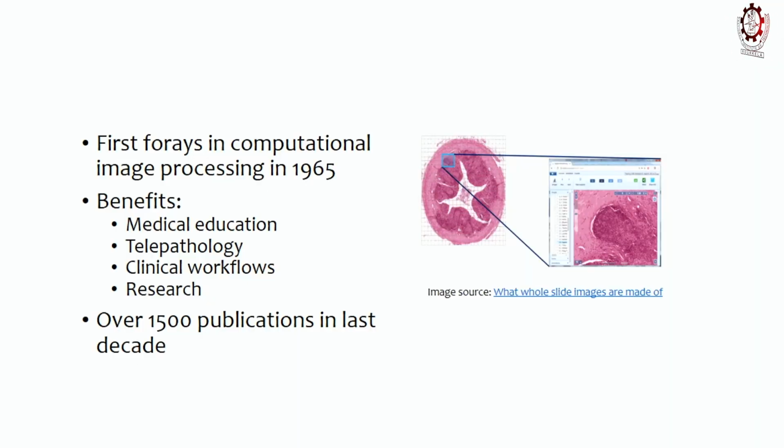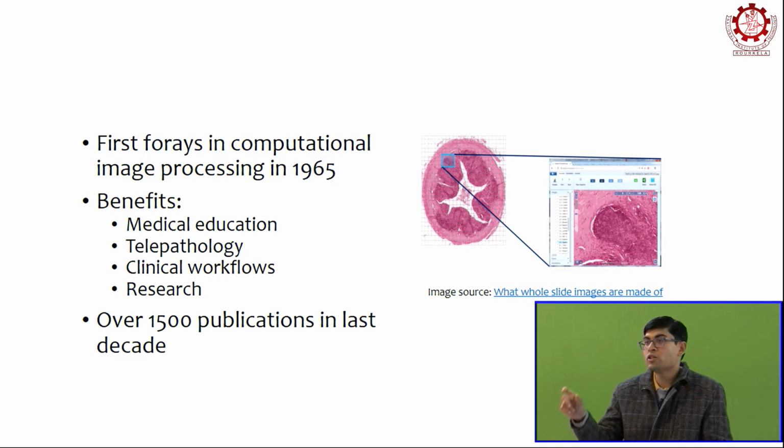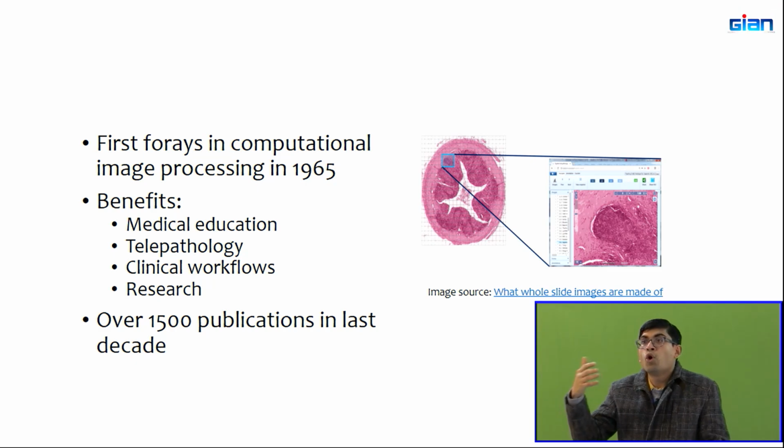So like I said, the benefits include medical education. Telepathology is important because a lot of times, for example in India, you might not have specialized pathologists at all places. There will be specialized pathologists somewhere else sitting remotely, but you would want to get their opinion.